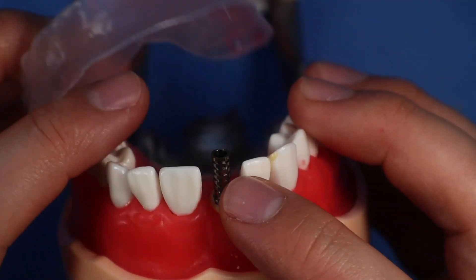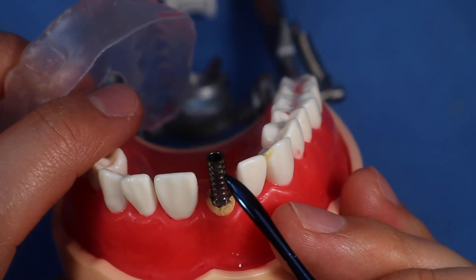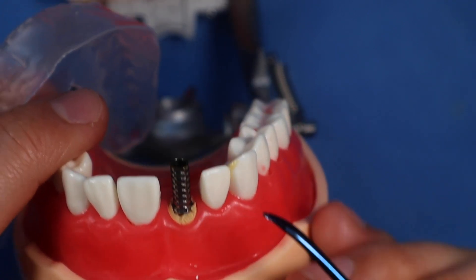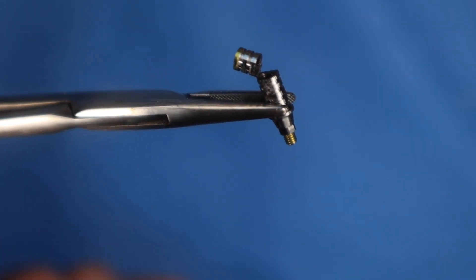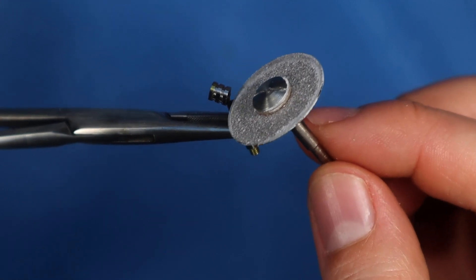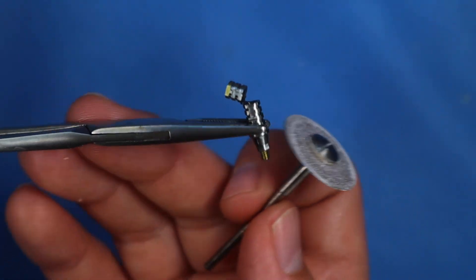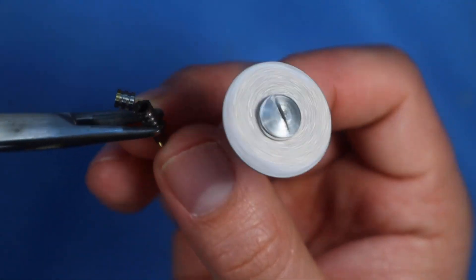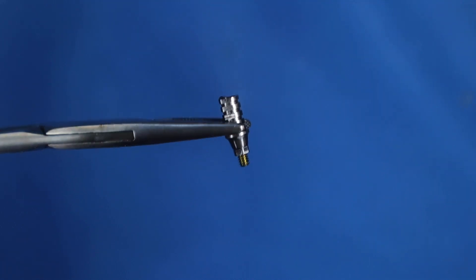The vacuform splint doesn't seat all the way because the titanium cylinder is too tall, so let's cut it. I'll mark where to cut it. What I do is hold it with hemostats, put a disc on a lab motor, and saw right there — dipping it in water if it gets too hot. You're never going to be able to hold this with your fingers and cut it. Hold the hemostats, cut it, and this part just comes right off. Easy peasy. Now you have a shortened titanium cylinder.